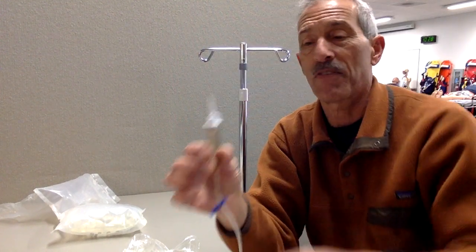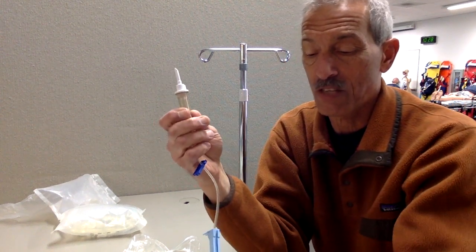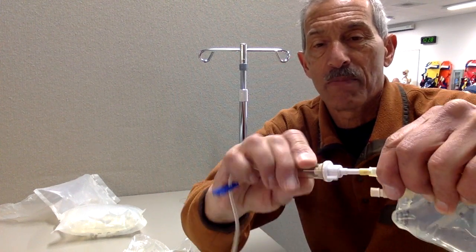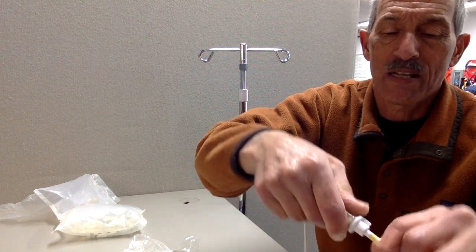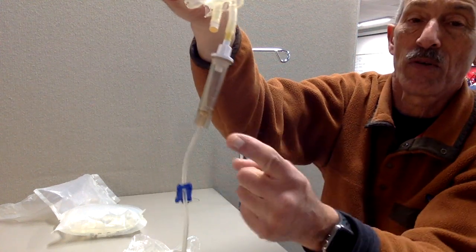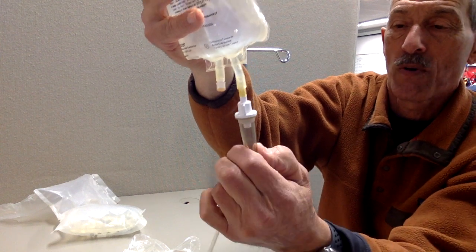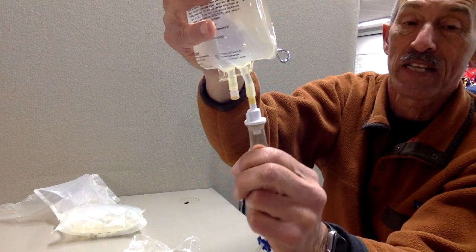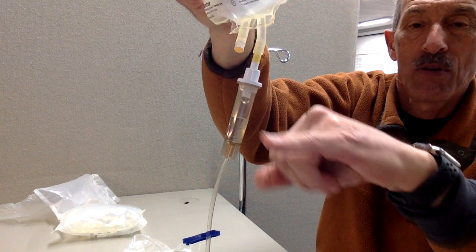Take the cap off — it's got a sharp spike on it, and that's a sterile area, so don't touch it. What you want to do is gently twist the spike back and forth into the bag until it goes all the way to the hub and breaks the seal inside. Now you want to fill the drip chamber about half full by squeezing it. You're getting normal saline into there — squeeze a couple of times until you're about half full in the drip chamber.